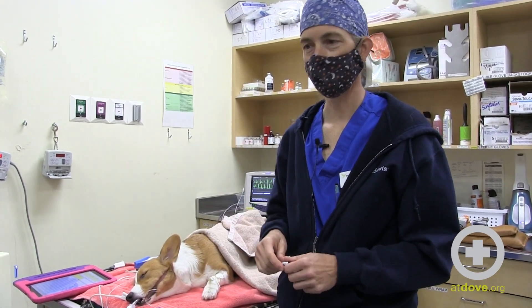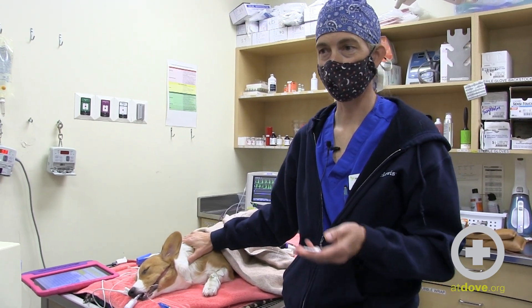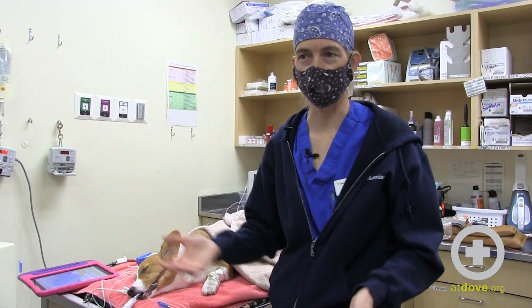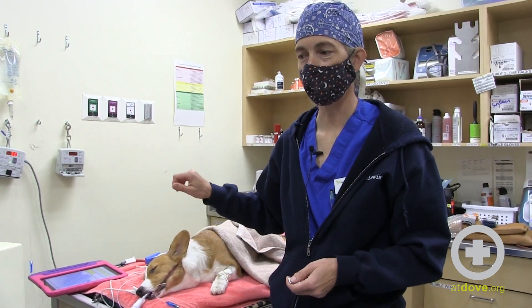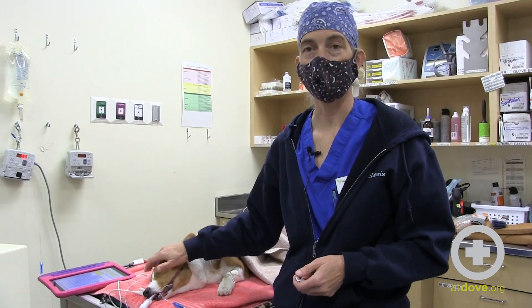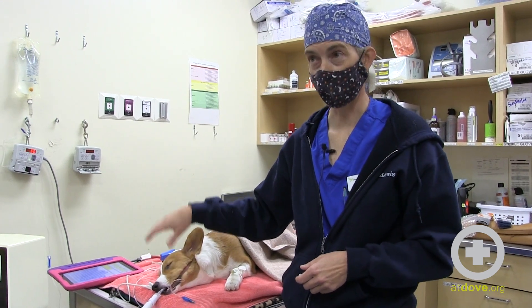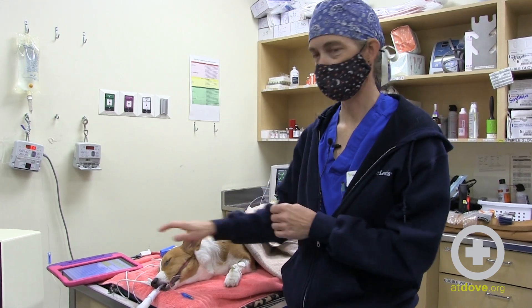Then we're going to flip her into dorsal for the rest of her prep. We don't usually have to reapply in a standard surgery that's going to be less than a couple of hours. Certainly a spay is going to be a quick one. If we were in there for a longer time and say she had an oral gastric tube passed and maybe some juice coming out of her mouth, we would probably flush her eyes while she's under anesthesia and reapply at that time. But most of the time, this is the only time that she'll get eye lube application.